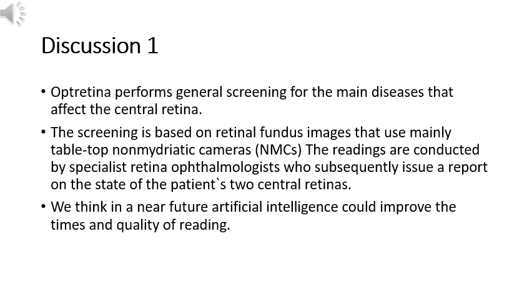The readings are conducted by specialist retina ophthalmologists who subsequently issue a report on the state of the patient's central retinas. We think, in a near future, artificial intelligence could improve the times and quality of reading, resulting in our readers having better outcomes than human-only readings. In order for this to occur, we must first guarantee the quality of the images.